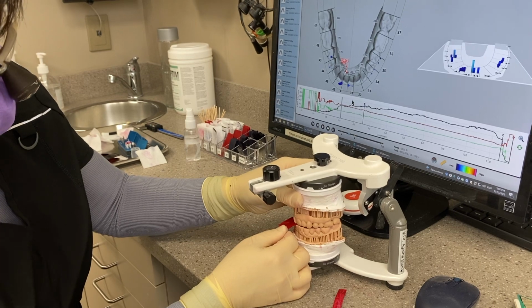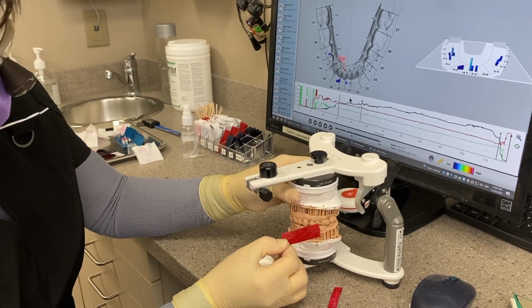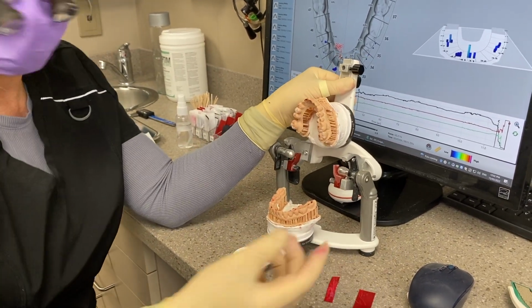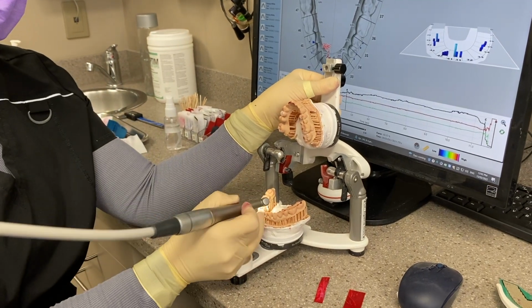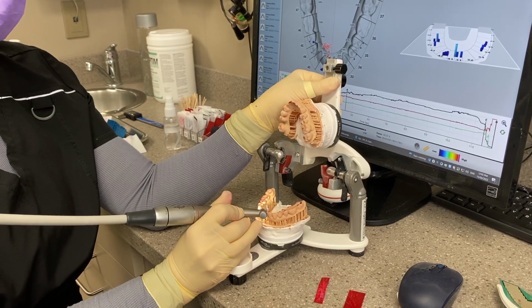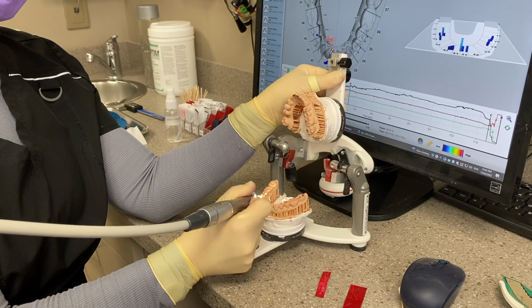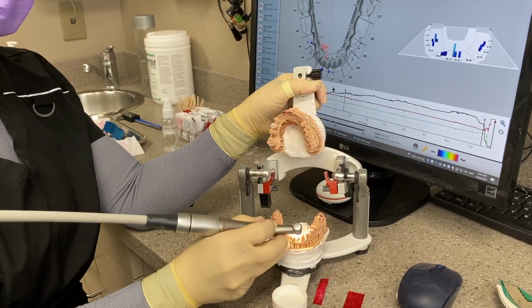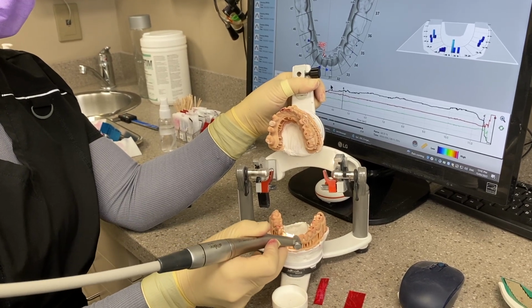Now, because she's about 2 millimeters too open, I have a lot of room, and I have a feeling, I want to do this exercise and have a chat with her, but I have a feeling she will actually prefer the equilibration and the odd restoration that needs to be done to restore her teeth over opening up the vertical. So she also doesn't have any TMJ symptoms. She doesn't have any headaches. The only thing she's got is the bone loss.